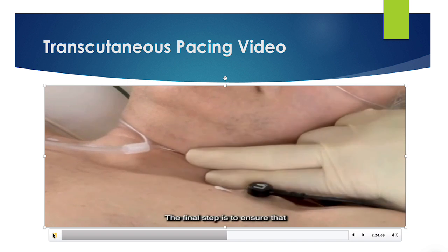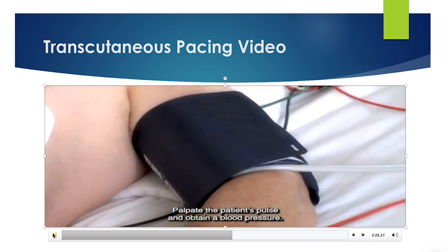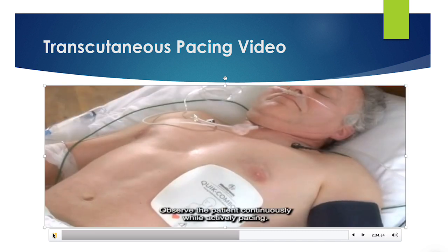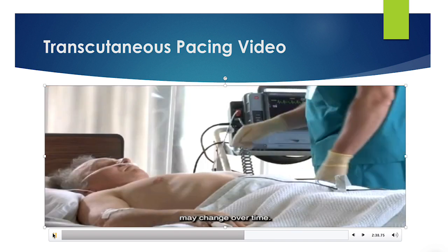The final step is to ensure that you also have mechanical capture. Palpate the patient's pulse and obtain a blood pressure. Pulse oximetry may also be useful. Observe the patient continuously while actively pacing. The patient's response to pacing therapy may change over time.